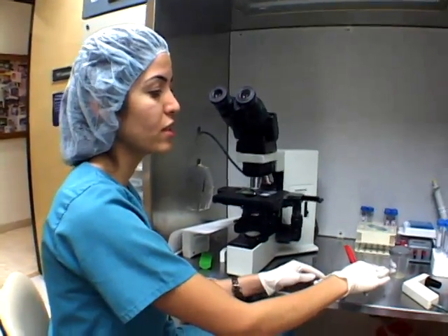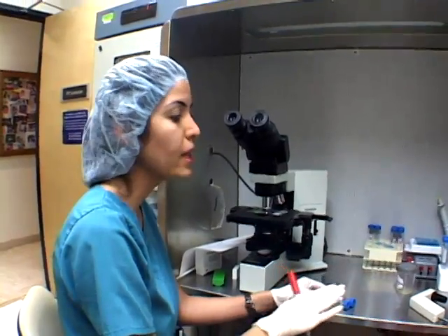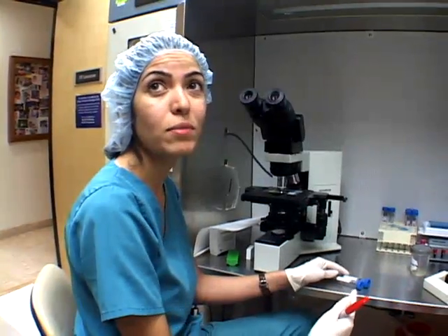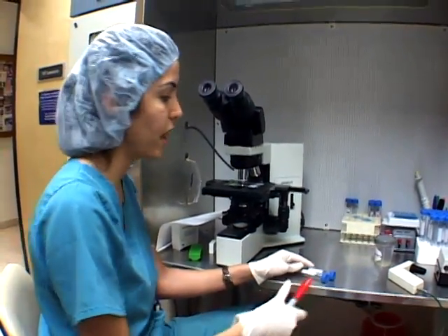We call this a semen analysis. The first step, we wash the sample one by one. Even if I have three or four samples at the same time, I never start to wash or prepare them at the same time. That's the perfect way to prevent any mistake in the IVF lab.